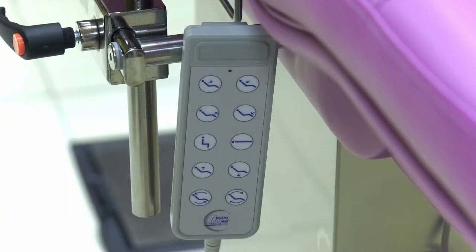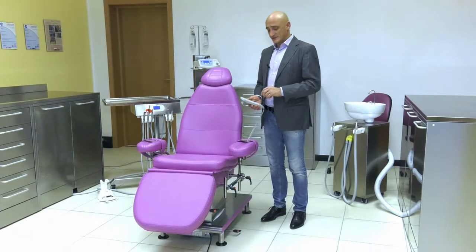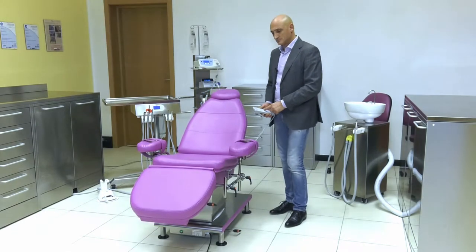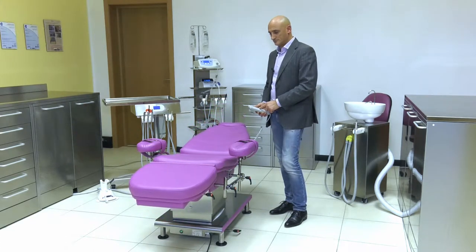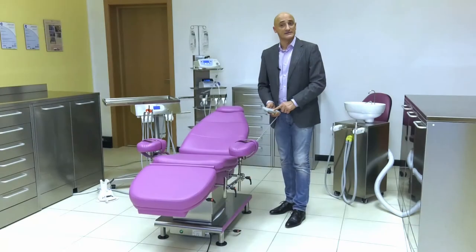If we look at the remote control panel, we can see two central buttons. These are used to position the chair, using only one action, into a reclined position, or in a seated position, to facilitate lifting and lowering the patient.